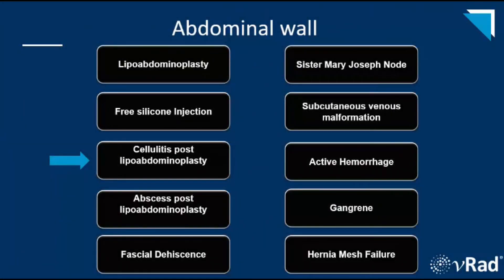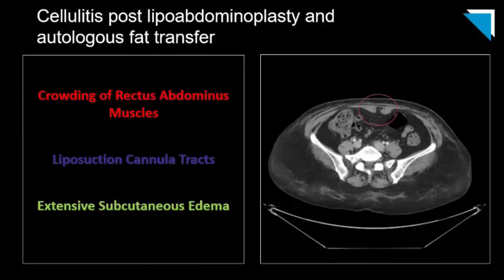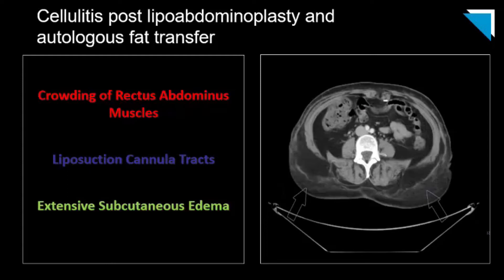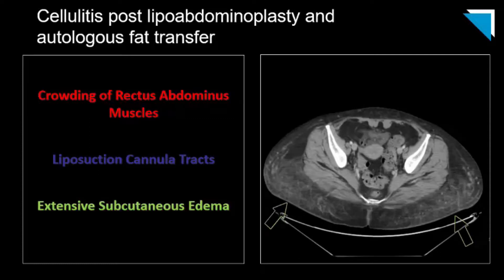Our next case is cellulitis following lipoabdominoplasty. This patient underwent lipoabdominoplasty and autologous fat transfer in addition to liposuction. We start again with our post-abdominoplasty findings — this midline crowding of the rectus muscles, outlined in a red circle. Then as we move caudally, we see the area of the fat grafting with extensive subcutaneous edema and skin thickening.